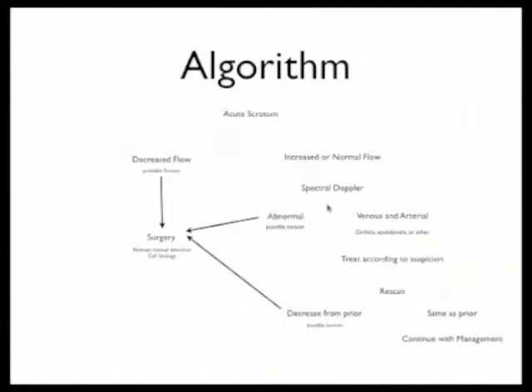And as we send more people over to radiology to confirm our studies, we're going to feel more comfortable with our findings. So, like with everything else in ultrasound, the more you do it, the better you get at it, the more comfortable you are making your own decisions. Just like with appendicitis, if we put forth the effort to actually do this scan and get better at it, then we'll be a little bit more comfortable making these disposition decisions.